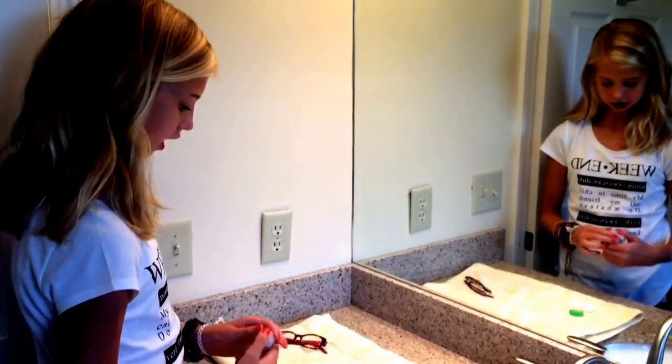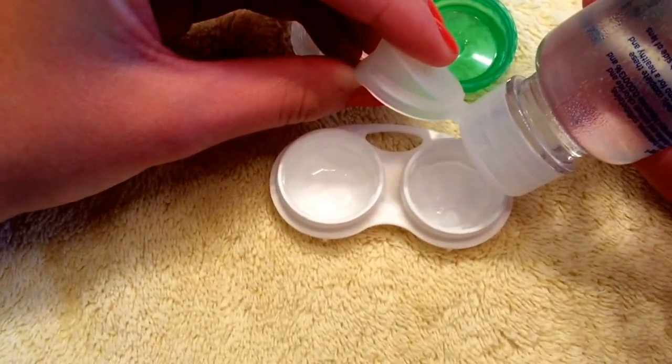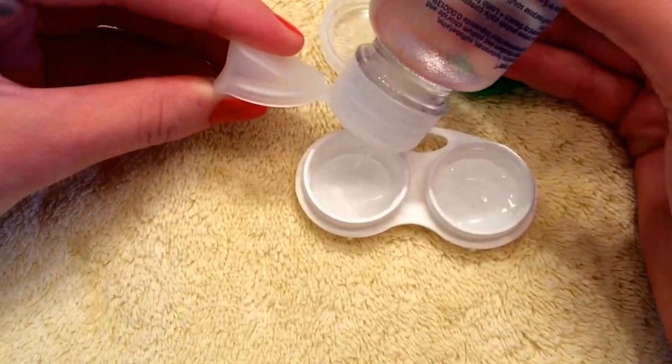Make sure to thoroughly dry it out. Now that we've cleaned our contact case out, it's time to put the solution in. Fill it about halfway.